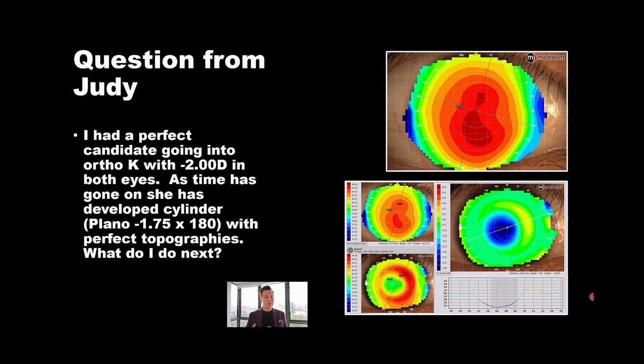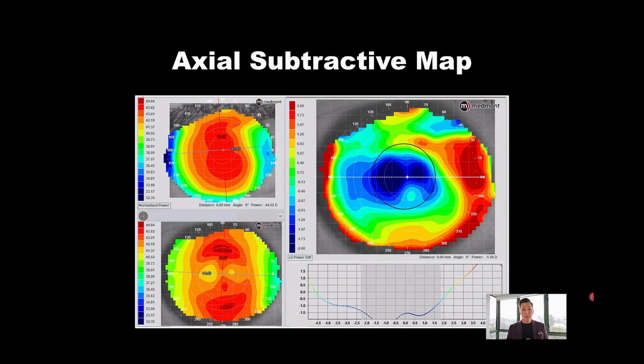So we've induced this astigmatism. Why? And how do we fix it? Well, here is the topography that was sent in, and you can see it looks like a relatively straightforward case, mostly apical astigmatism, maybe arguably a little more limbus to limbus. It's a composite map, and that red vertical meridian seems to extend a fair ways across the eye. So that could be the culprit here.